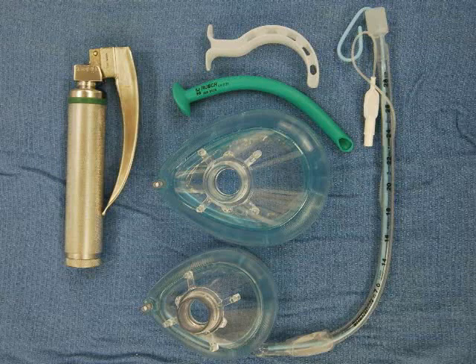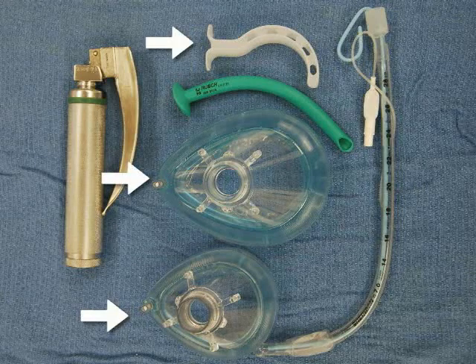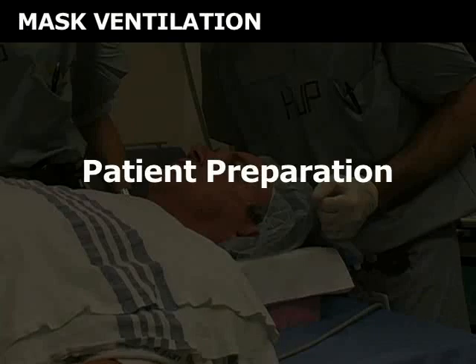Emergency airway equipment must be accessible prior to initiating mask ventilation. This includes laryngoscope blades and appropriately sized endotracheal tubes. Also, a variety of face masks and oral and nasal airways.